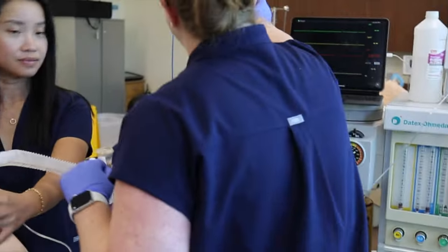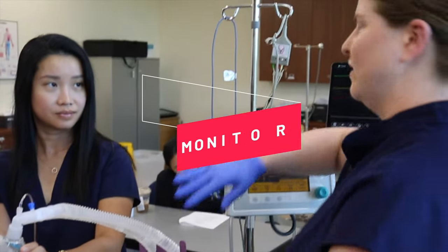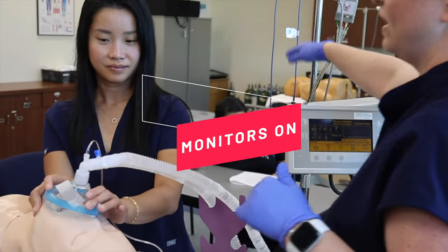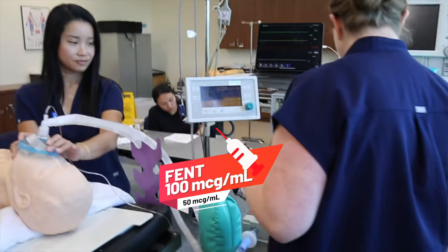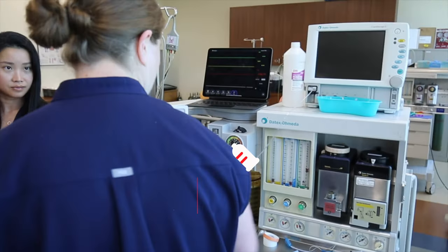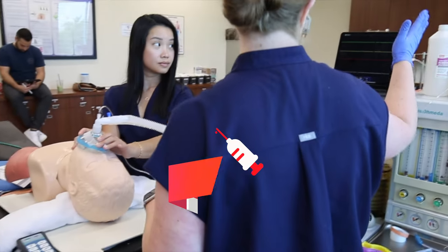I'm going to put my EKG leads on. There's no way to actually put them on this, so this is a verbalizing thing. So we're putting on my EKG, pulse ox, and blood pressure. I'm going to cycle a blood pressure. And I'm going to give the fentanyl. And I'm going to give the 100 milligrams of lidocaine. All right, keep taking those really big, deep breaths.